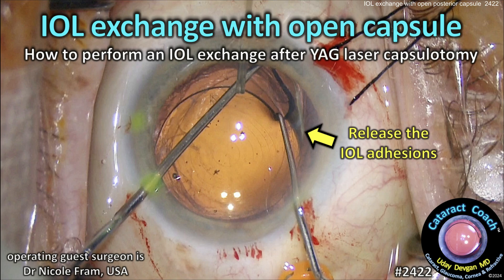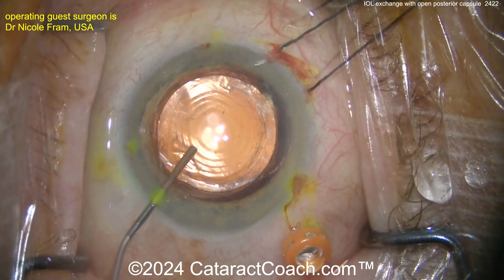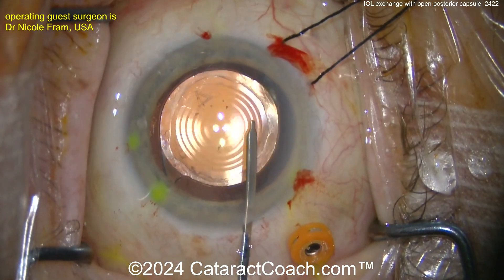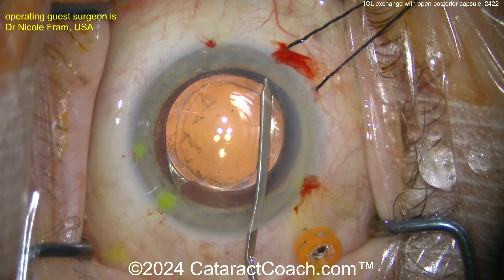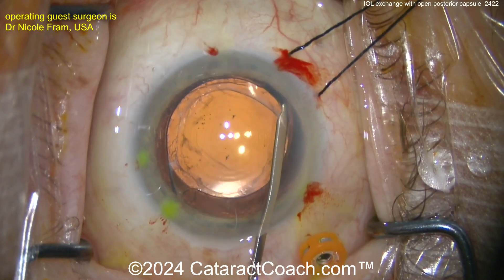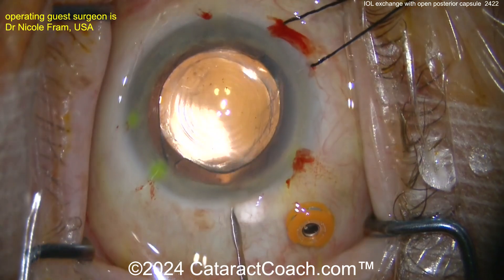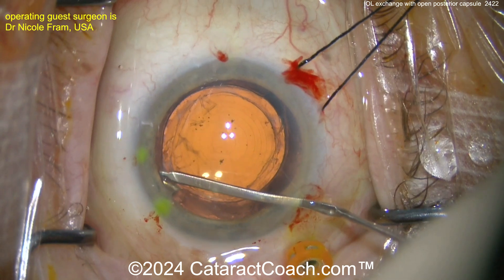cataractcoach.com — IOL exchange with an open posterior capsule: how to perform this lens exchange after a YAG capsulotomy is already done. If you listen to our podcast like smart ophthalmologists do, yesterday's podcast featured Dr. Nicole Fram. We talked about challenging cases — she's a cataract refractive anterior segment surgeon who does a lot of these re-operation cases here in Los Angeles. This patient has what looks like a trifocal, probably an Alcon PanOptix lens, already in the bag with a prior YAG capsulotomy.